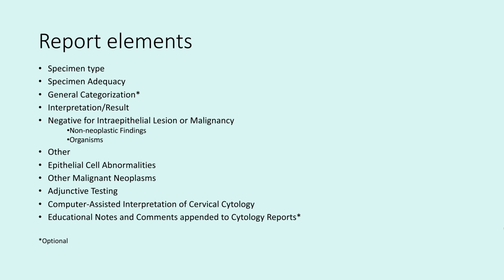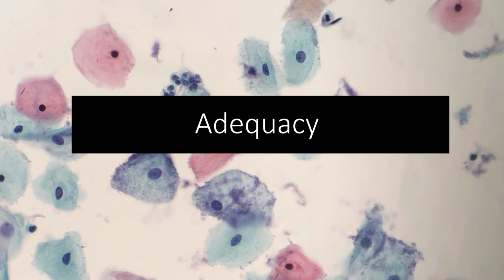And then if you do adjunctive testing, especially HPV testing or IHC, some people do, you have to note that in the report. And if you perform computer-assisted interpretation, you have to note which device you used and how you used it. And then for educational notes and comments, some people like to put management recommendations into their reports, and that's all using published guidelines.